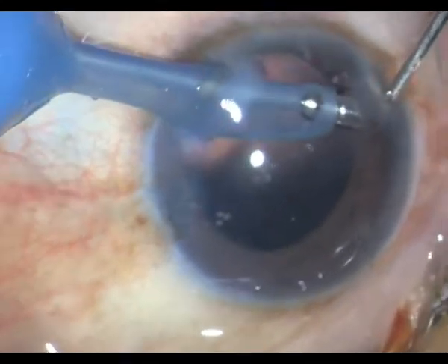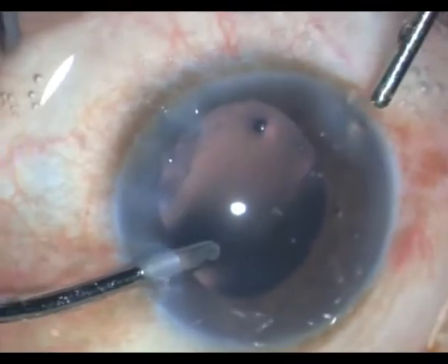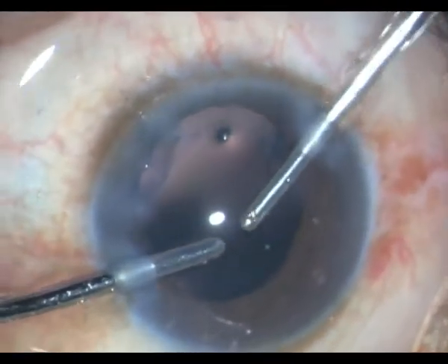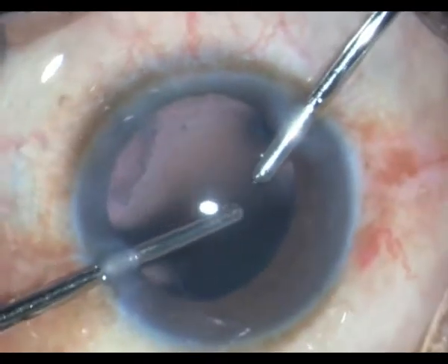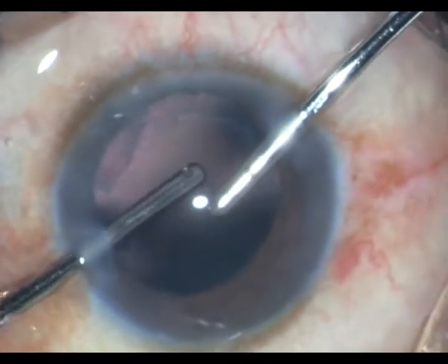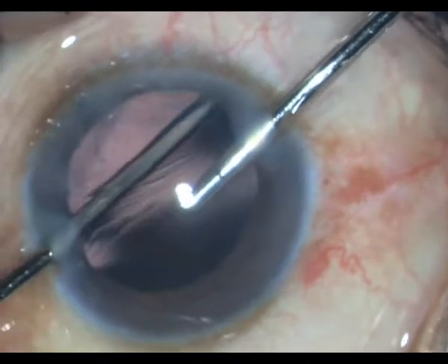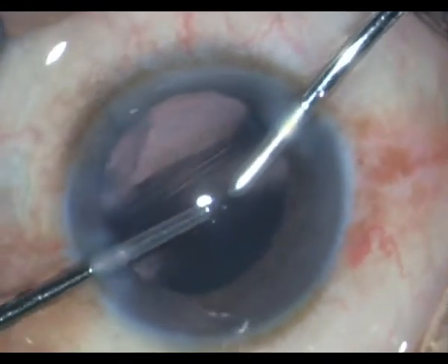A little tiny bit of nuclear fragments I emulsify and then go in with my bimanual. Once removed I can safely come out. There is hardly any cortex, just polishing a bit of the capsule.